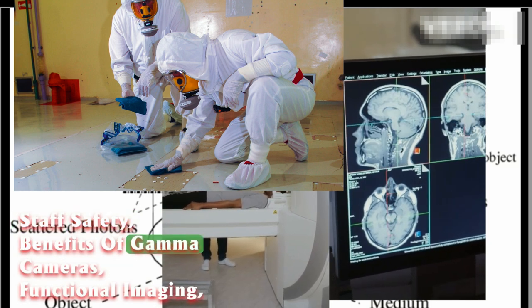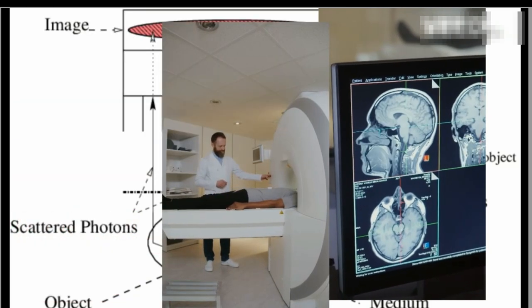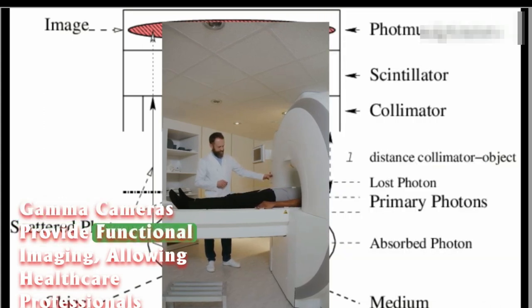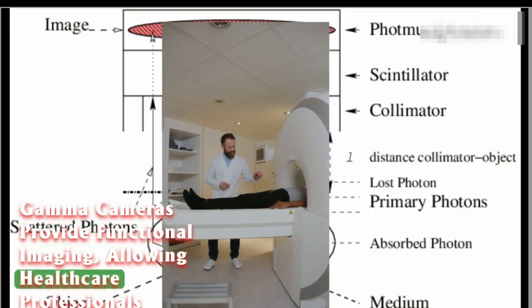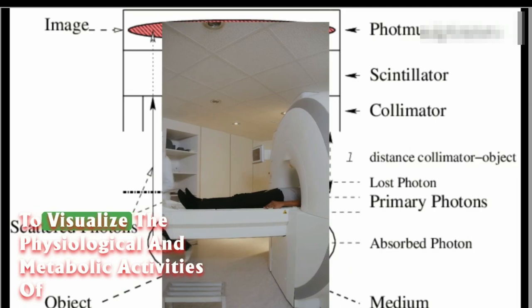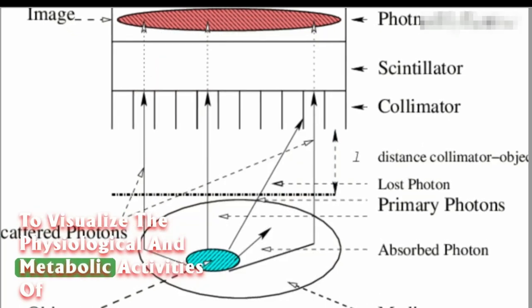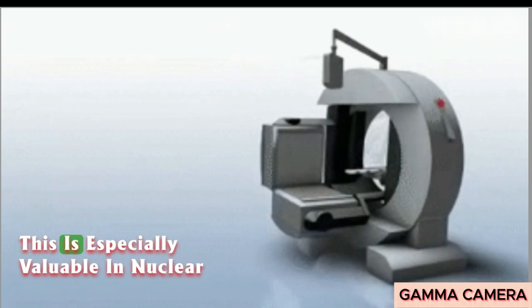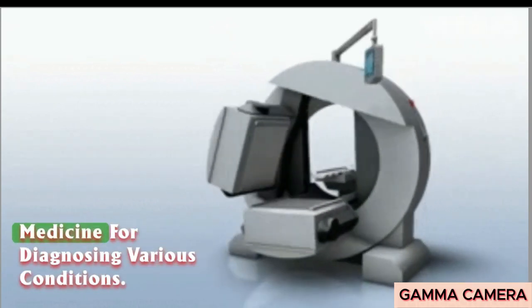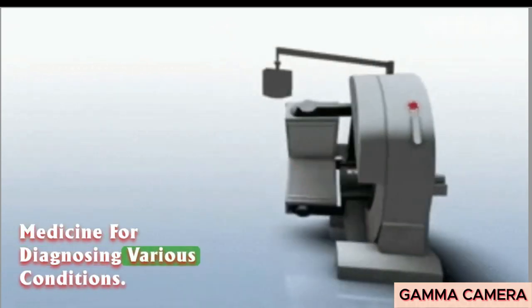Benefits of gamma cameras: Functional imaging. Gamma cameras provide functional imaging, allowing healthcare professionals to visualize the physiological and metabolic activities of organs and tissues. This is especially valuable in nuclear medicine for diagnosing various conditions.